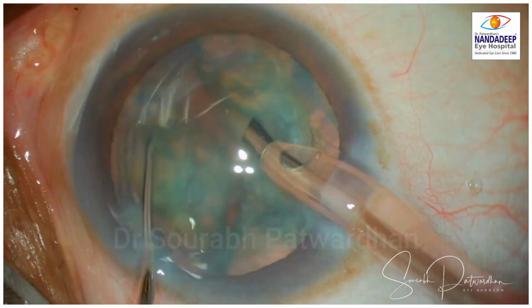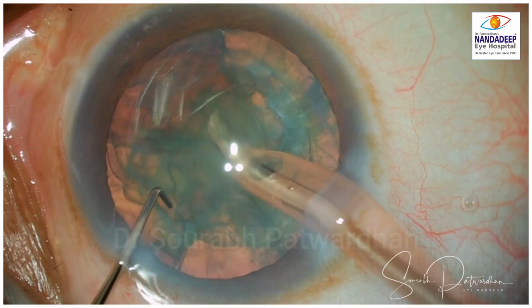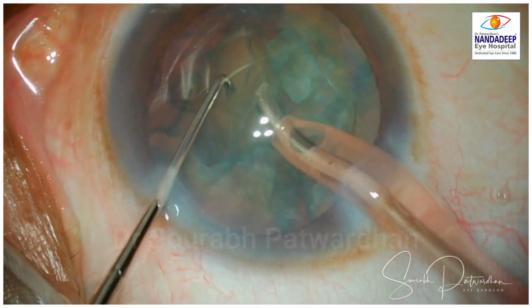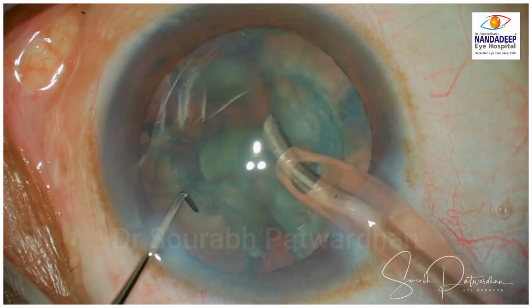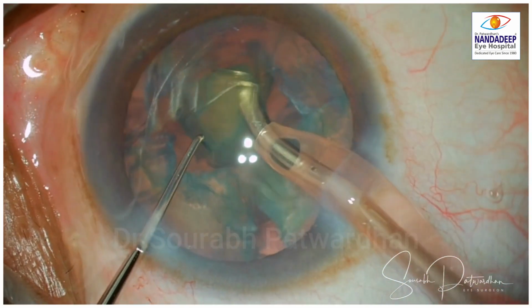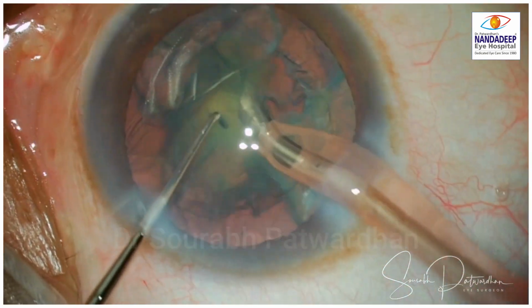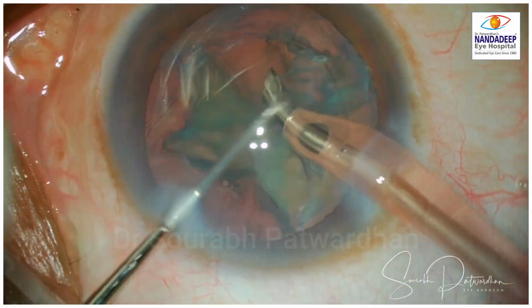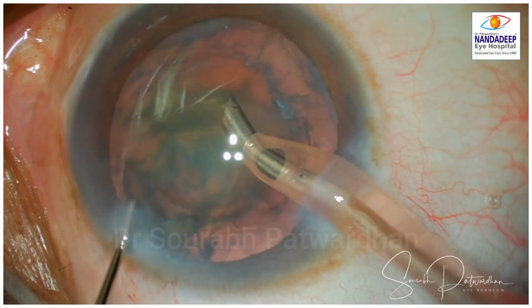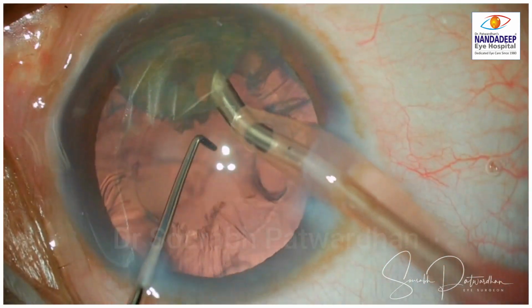The bag appeared extremely stable. The emulsification process was uneventful. The flowability was good. There was no vitreous thrust or any movement of the bag throughout the procedure.